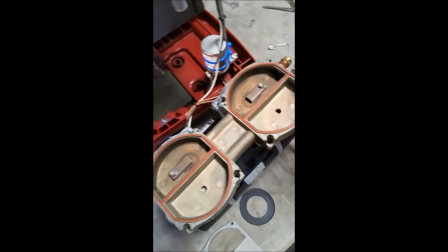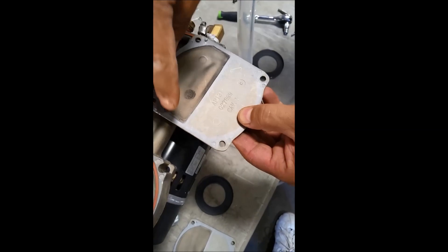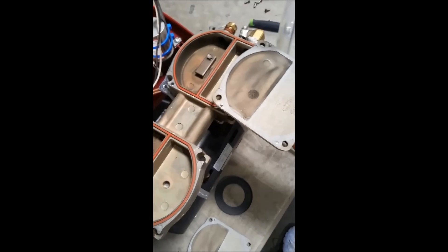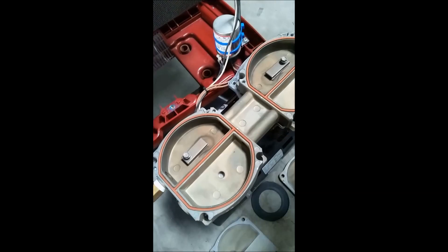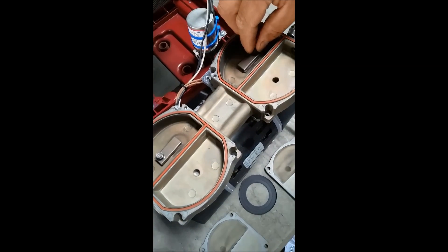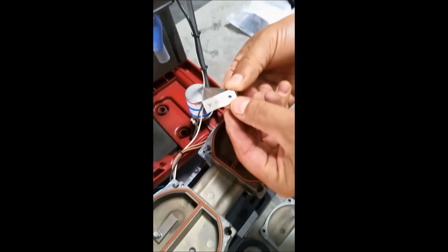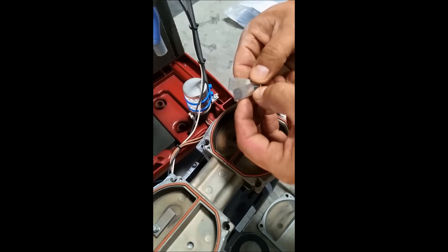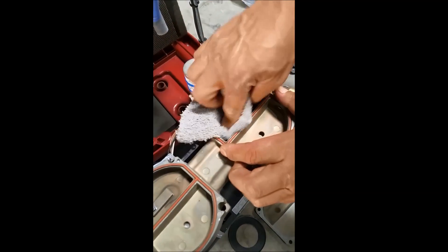We're basically going to create the same process we just did with these inner seals. You can see how dirty this is and how dirty it is in there, so we're going to clean it off a little. Just as before, loosen with your socket and use your manual screwdriver to get the small screws off and remove these tabs. You'll see how dirty it looks and that's why we want to replace it. Now we're going to clean all the way around the area.